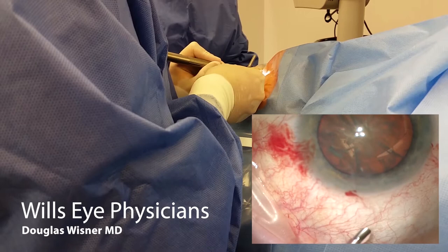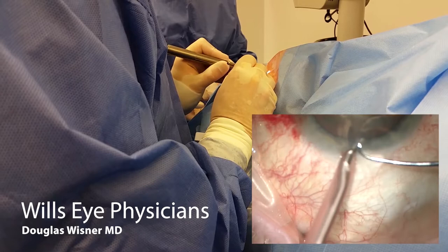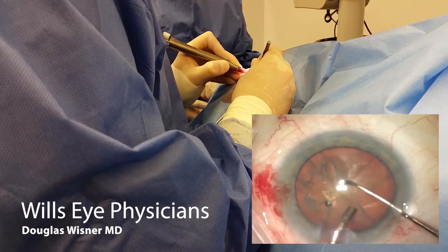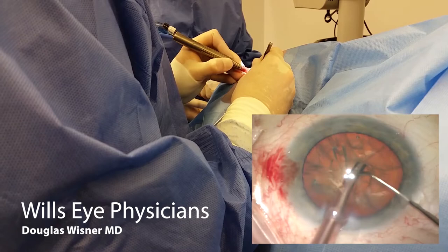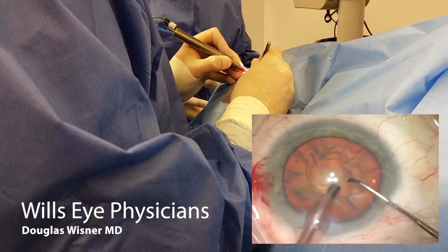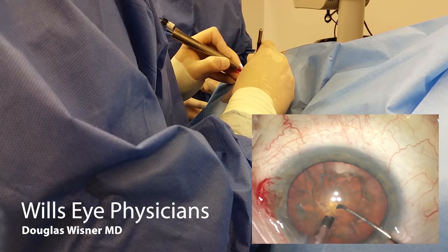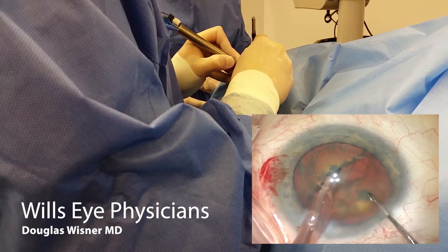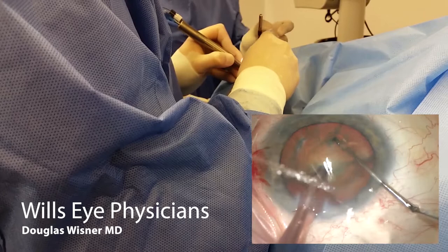If you try to spin and you're not peripheral, you're just going to end up pushing posterior on the lens. Here I'm using a balanced phaco tip, showing enough metal up to the bend in the balanced tip in order to get adequate hold on the material for a chopping technique. This is a Nicomin chopper used for a vertical quick chop. Here I'm clearing off the cortex, sometimes applying a little bit of phaco power to do so. Once I'm clear, I'll have a very steep angle of attack and angle my phaco tip all the way in until the silicone sleeve is occluded. Then I drop my second instrument in, out near the rhexis, and slide back towards my phaco tip and spread, sometimes doing a cross-action.